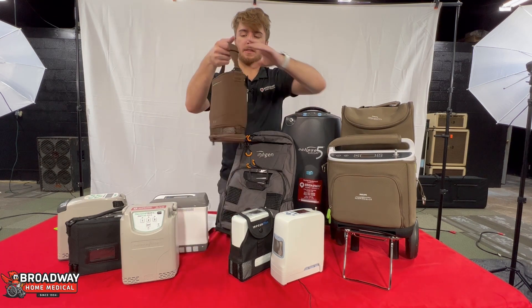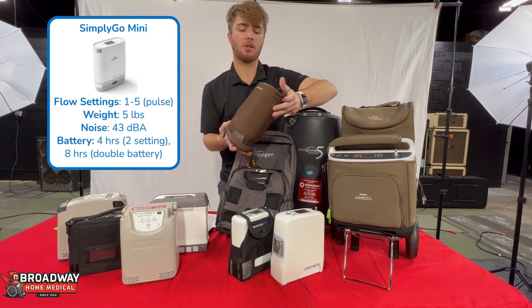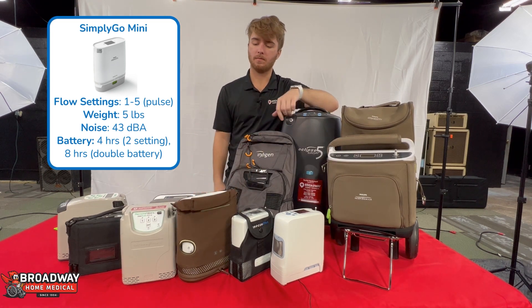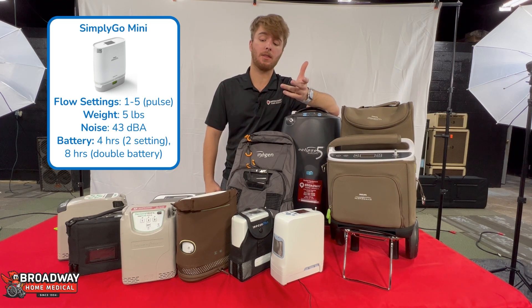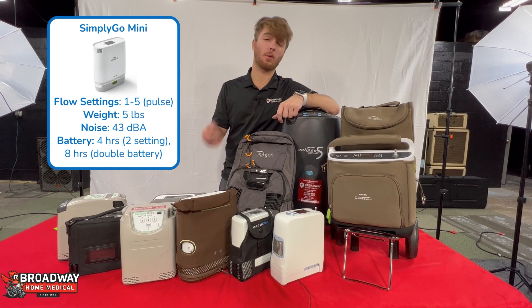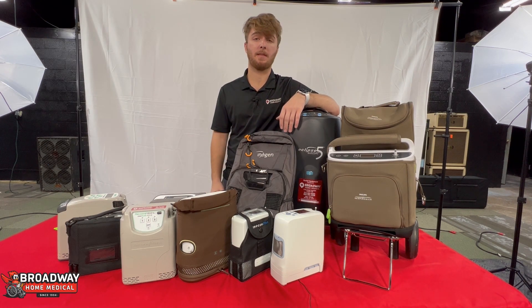Moving on, we have the Simply Go Mini — slick, stylish, with an LED screen on top. It's nice and quiet. The standout feature with that one is the LED screen, and it also has a really slick-looking backpack. Really stylish, and that's a really nice thing to have out there.